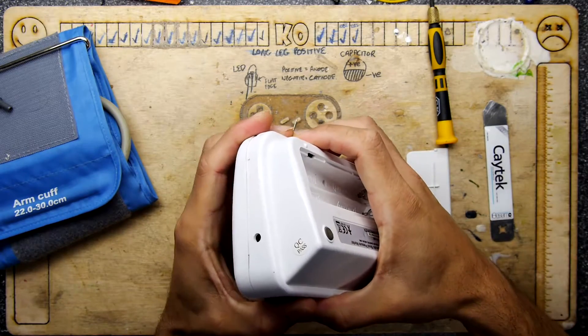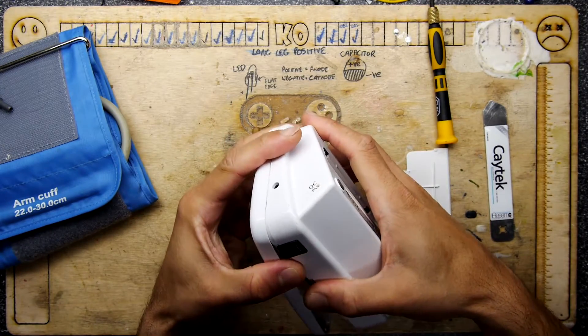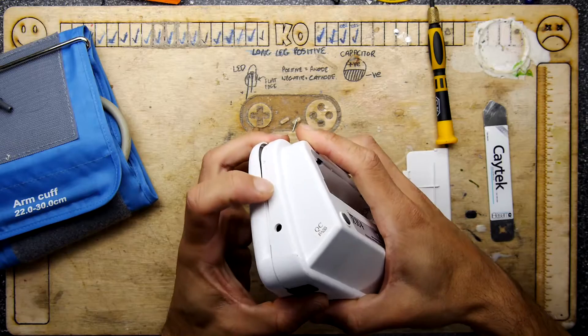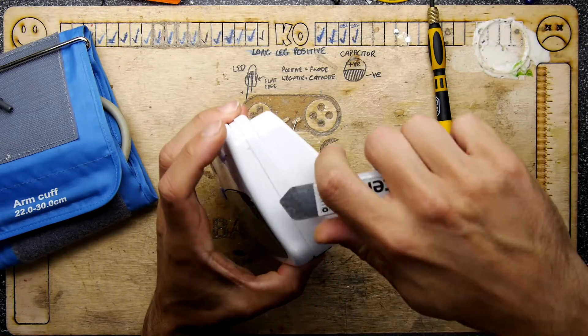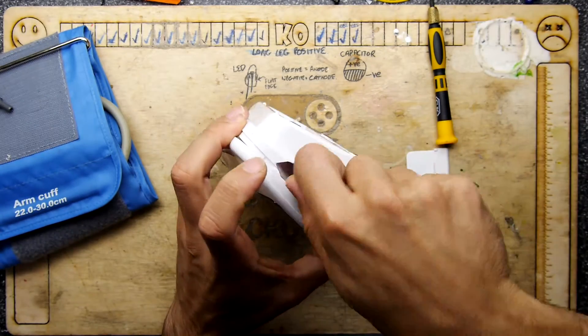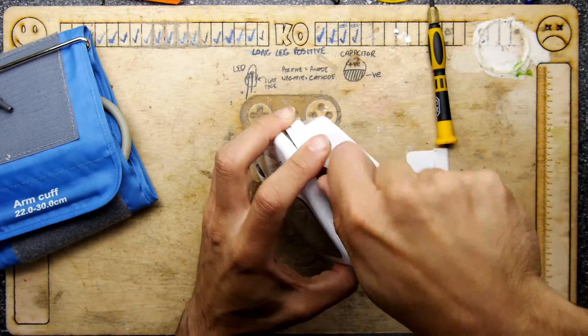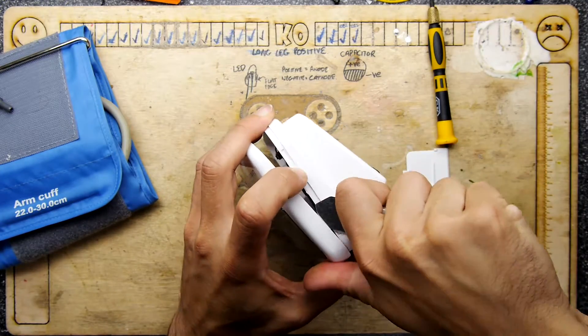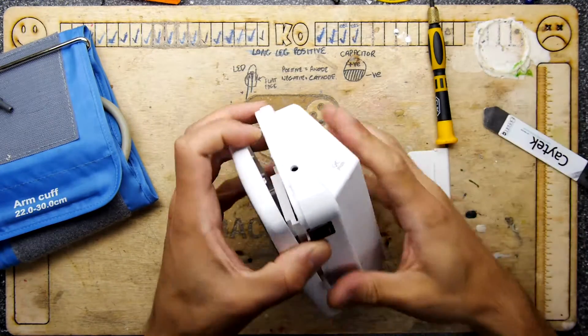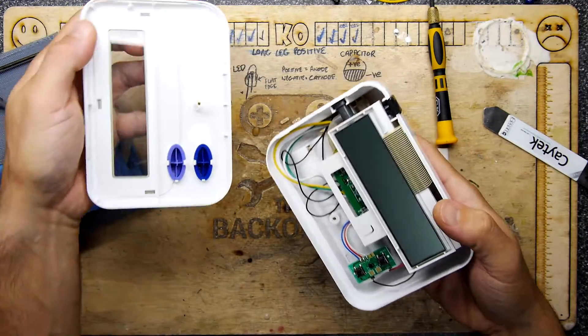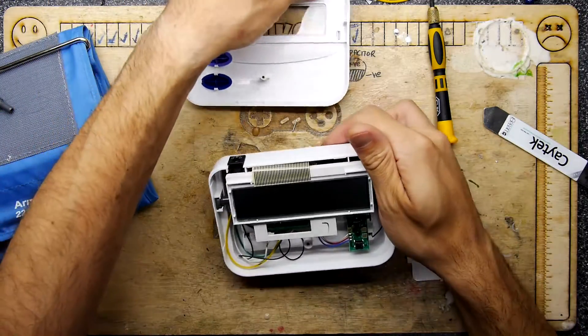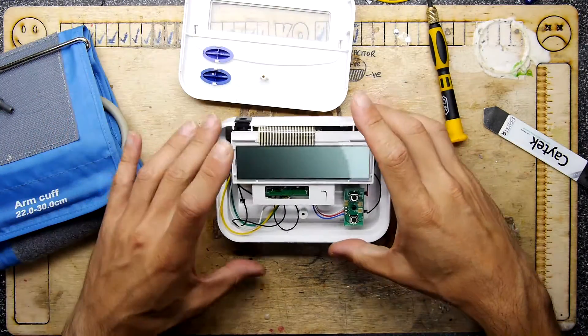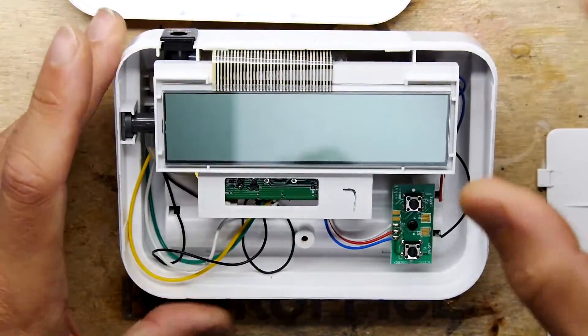So there's a lot of snap clips on this thing. One more, one more. We're almost there. Come on now. There we go. Nice and simple then so far. Let's have a little zoom in.